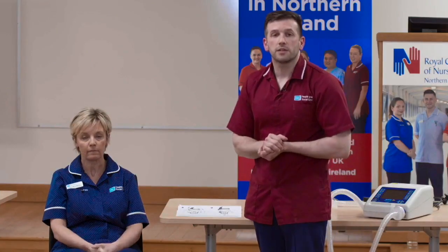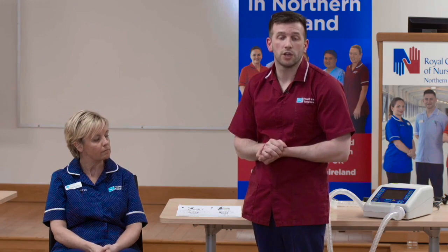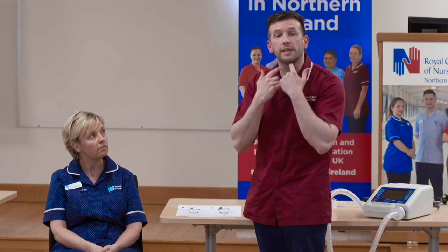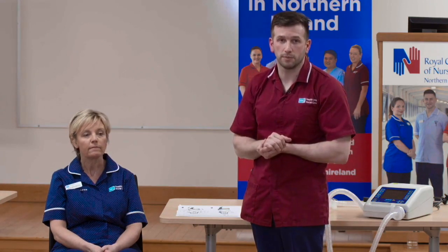The interfaces come in 3 sizes commonly: small, medium and large. And it's very important that you pick the appropriate size for your patient, not only for patient comfort, but to make sure that the mask forms a tight-fitting seal so the patient can receive their therapy as best possible.